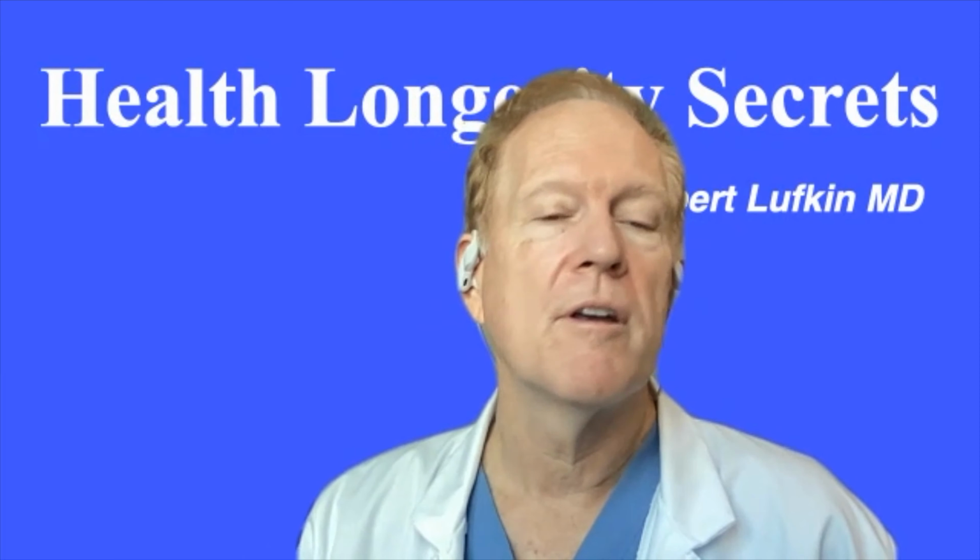So the highest level then we have where we want 3D anatomy, and it actually can measure muscle volume and fat volume and differentiate between body fat and visceral fat, subcutaneous fat and visceral fat. That would be an imaging test.